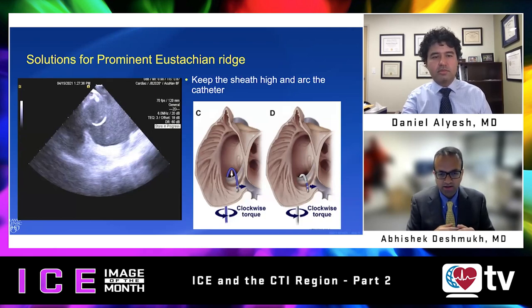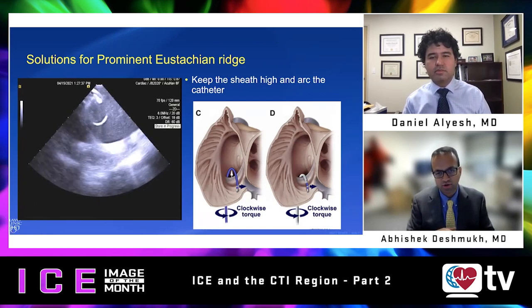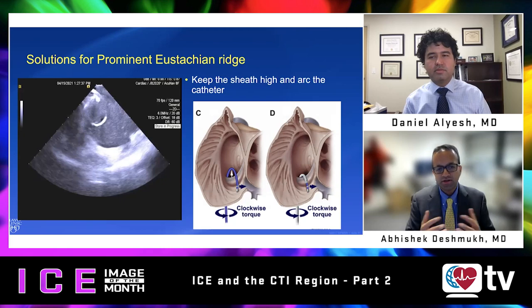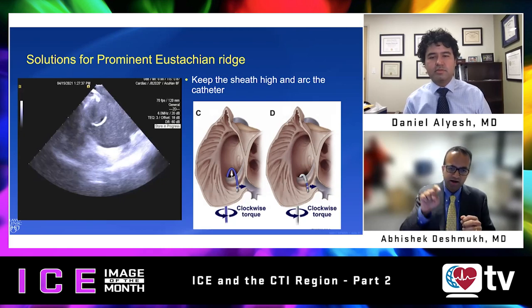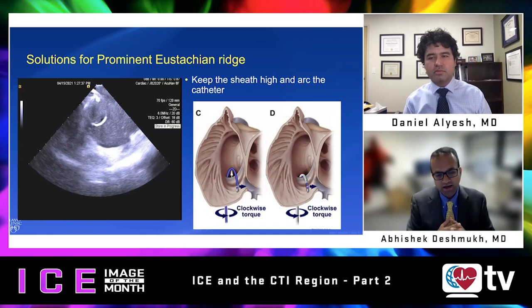If you're advancing a wire or any catheter from the IVC into the right atrium and you suddenly feel some obstruction, or the catheter or wire is not going straight up to the SVC, then you may want to think you are dealing with a prominent eustachian ridge. Another sign is if the CS catheter has to bend down more towards the ventricle and you have to do a very steep clock to get into the CS.